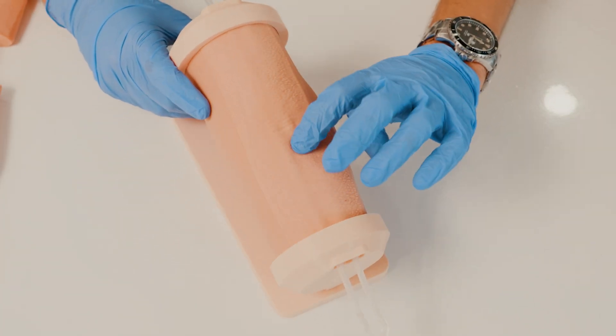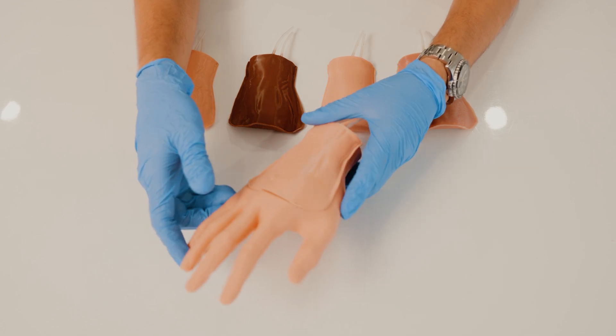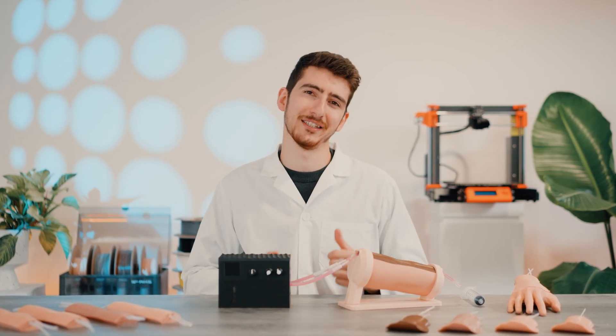Our blood circulation unit is compatible with both venipuncture and IV cannulation sets. This allows you up to 10 patients to practice with. All of these models can be found at proxsimity.net and our Amazon store. So remember, practice anywhere, anytime.